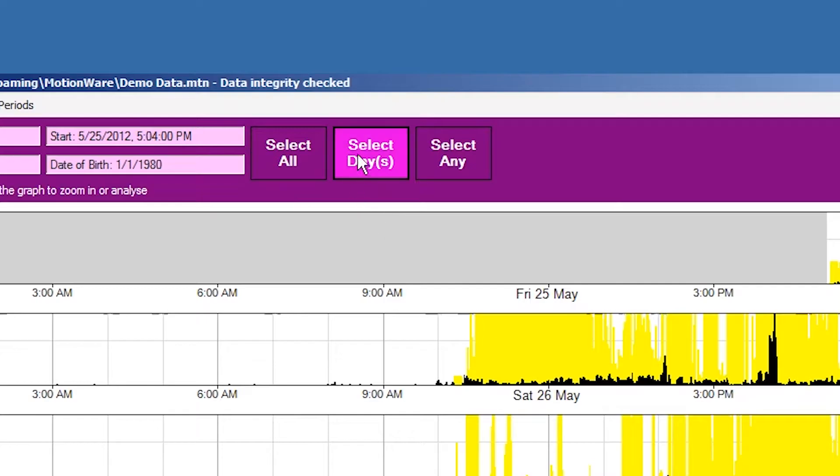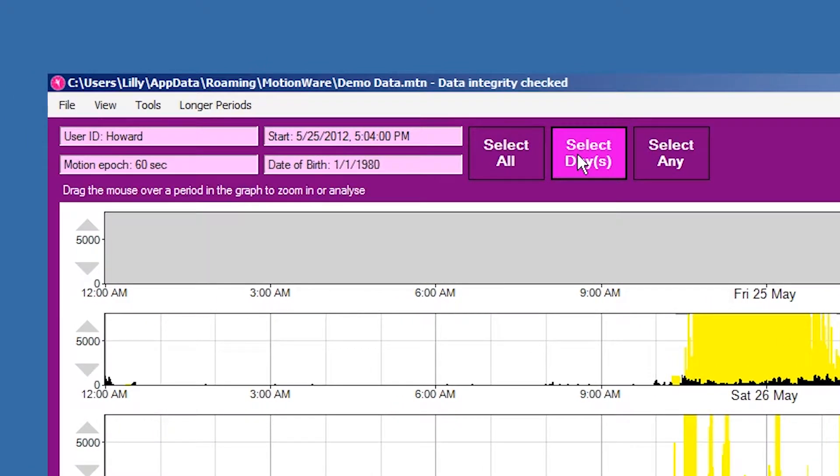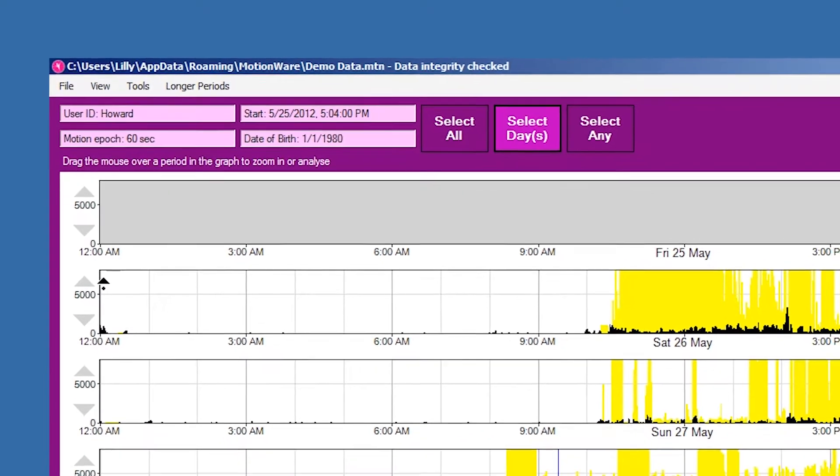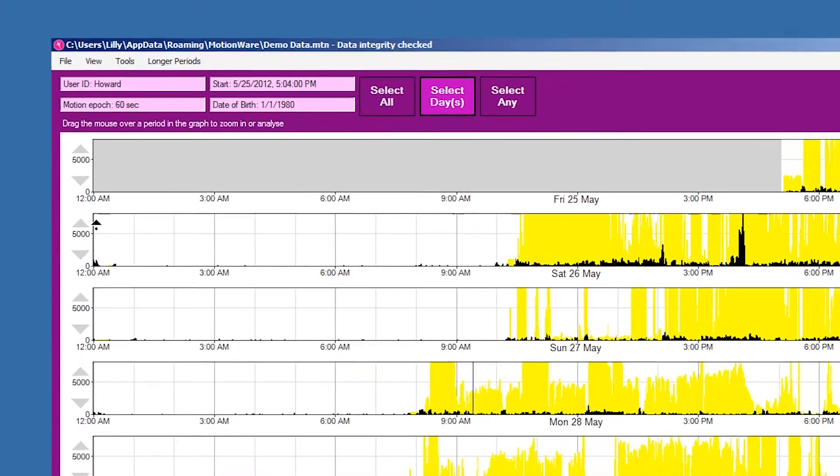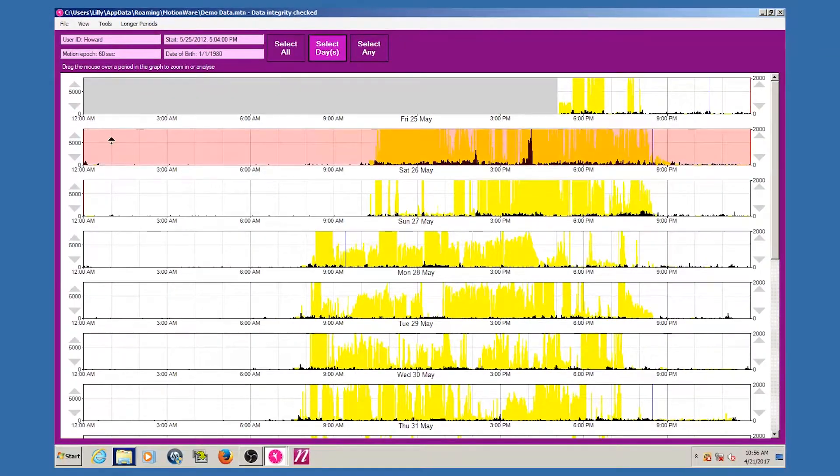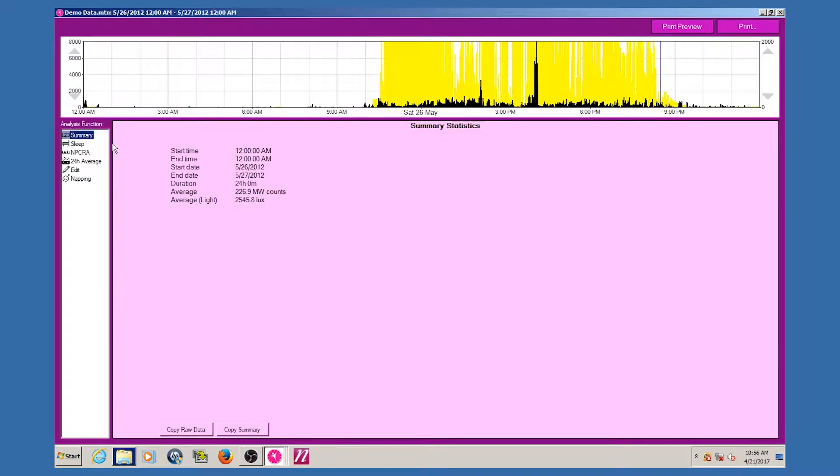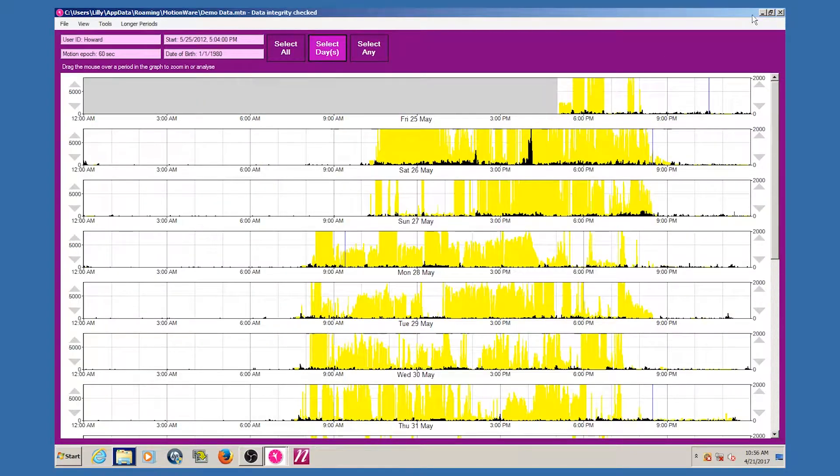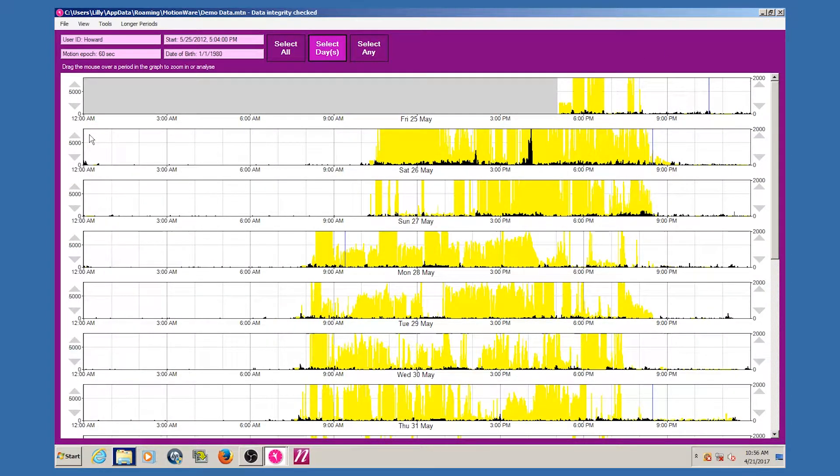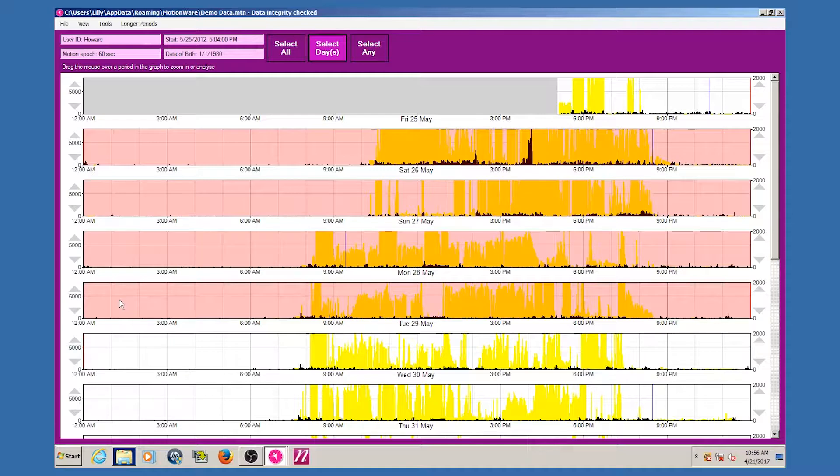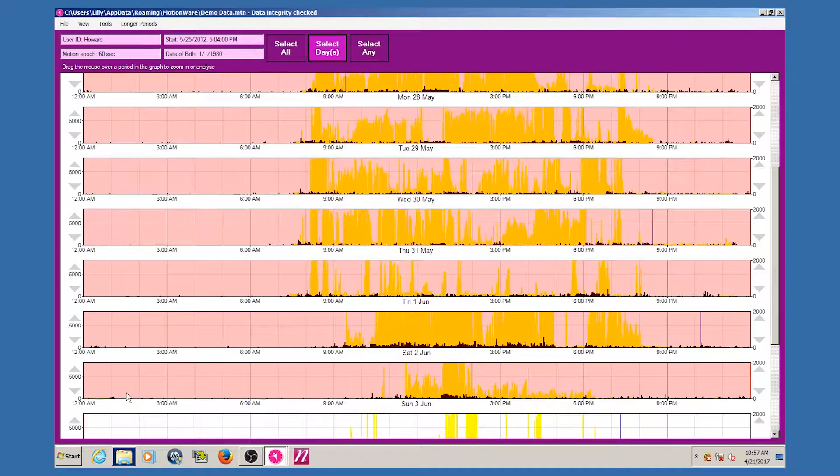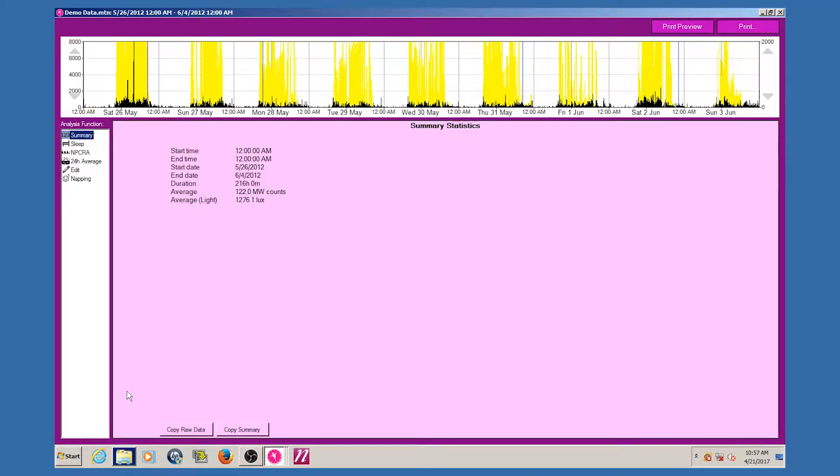The select days option will select a period starting and ending at midnight on the chosen days. To make a selection, point anywhere within the graph on the day of interest, hold down the left mouse button, and then drag to select the days required. Drag across multiple graphs to select several days, and drag off the bottom or top of the motion-wise graph area to automatically scroll while selecting.